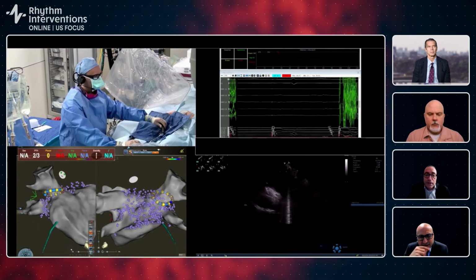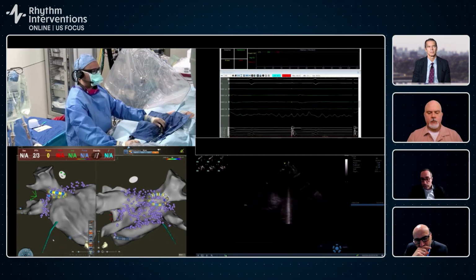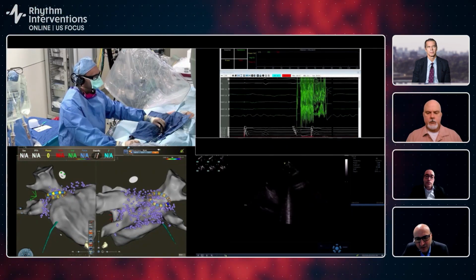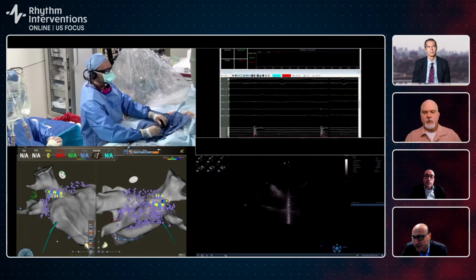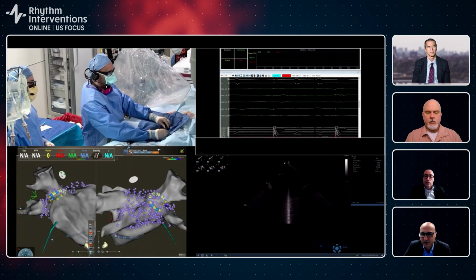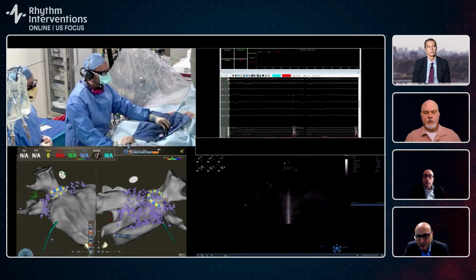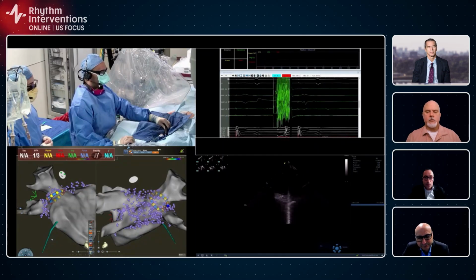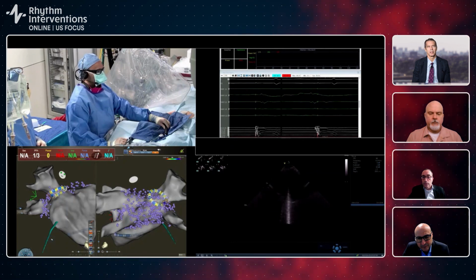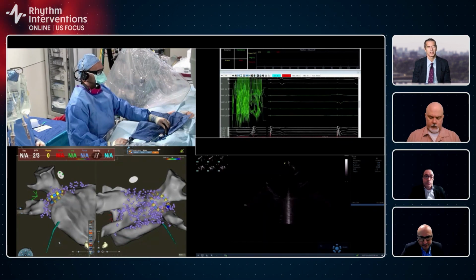So I just want to make a point. We moved now, but before, if you see here, I was ablating here earlier, and I removed all the proximal electrodes because they were just floating. So here is another example where it would be useful to remove some of the electrodes. If you're in a place where half of the electrodes are just floating and you don't want to cause hemolysis, you can remove them. Yeah, I think that would be the most common reason to consider doing this, if you have electrodes floating over the ostium of the vein. Sure.